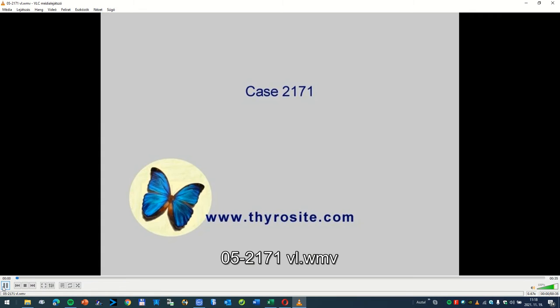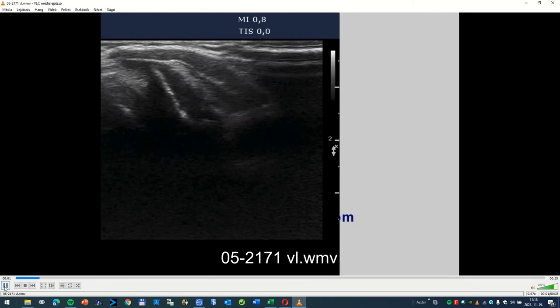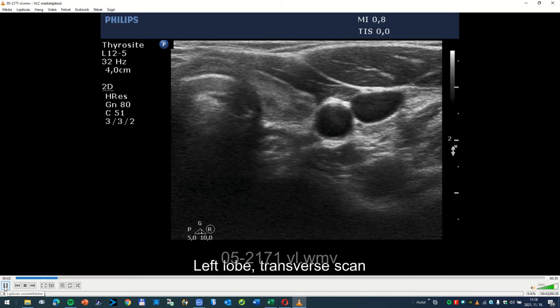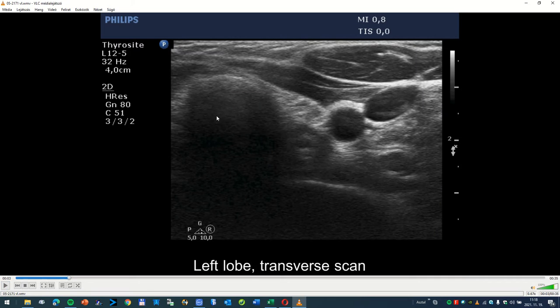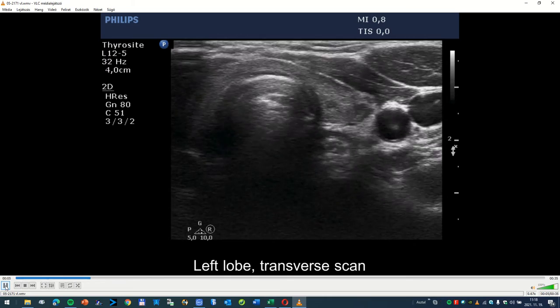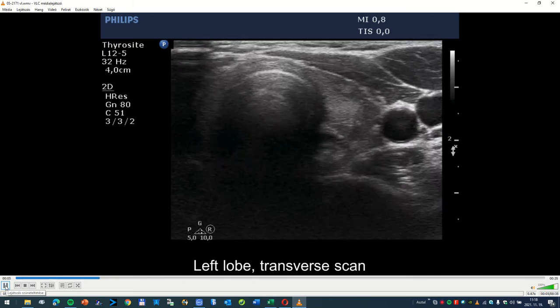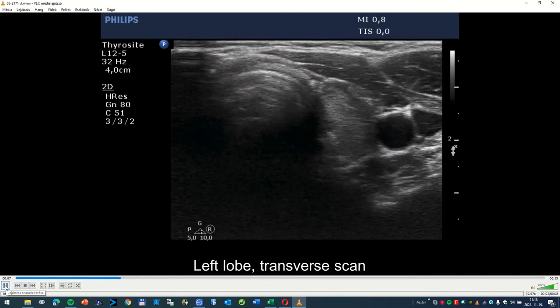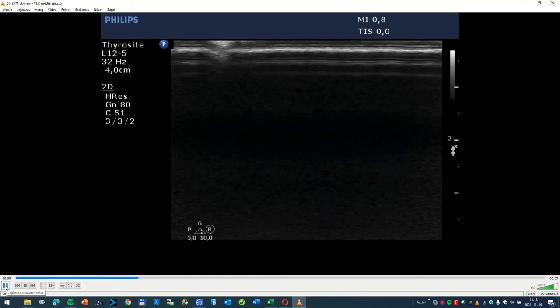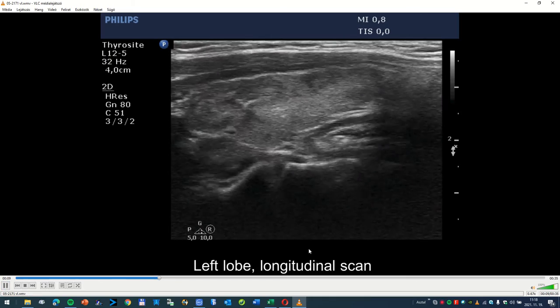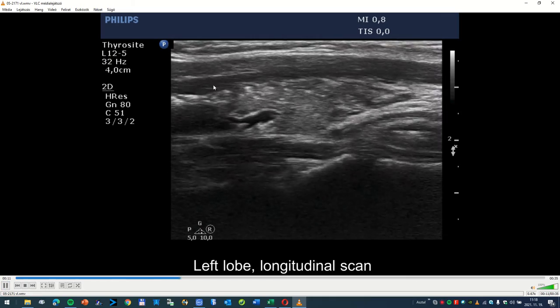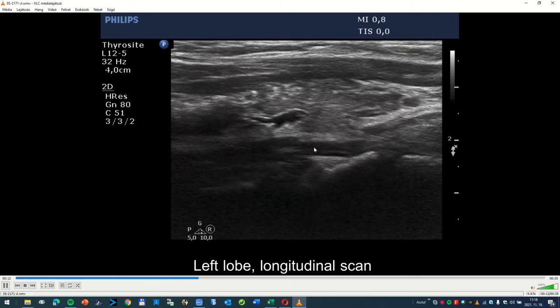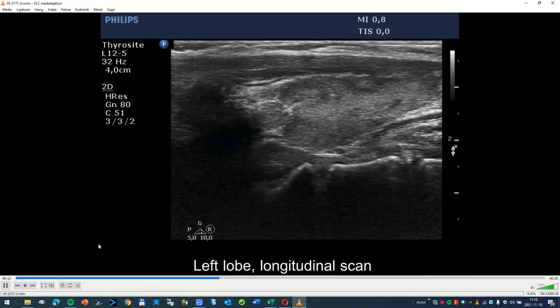And one more consideration: the transverse section has much less relevance. Here, I think this is the suspicious area of the thyroid, but on the transverse scan we cannot see this. The longitudinal scan is more appropriate to judge the thyroid, because we see a much larger part of the thyroid on longitudinal scan compared with the transverse view.